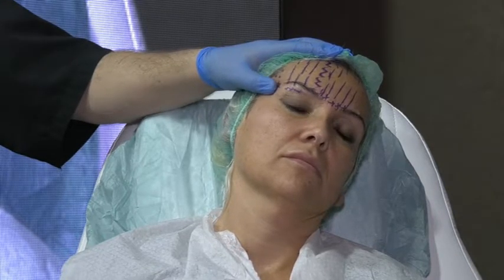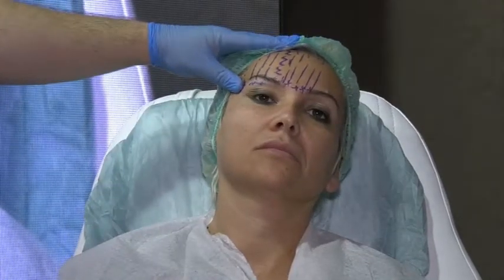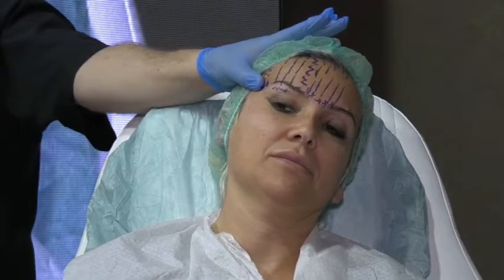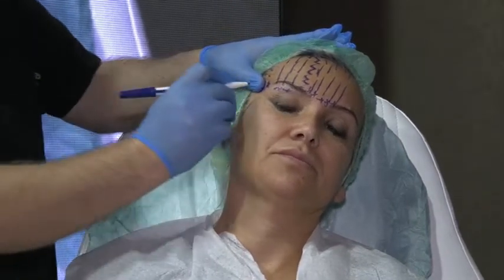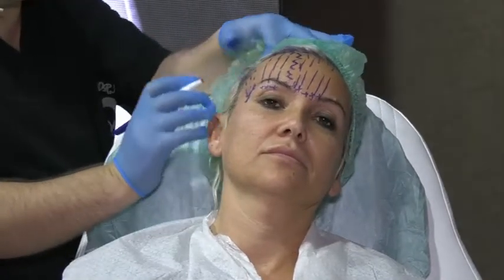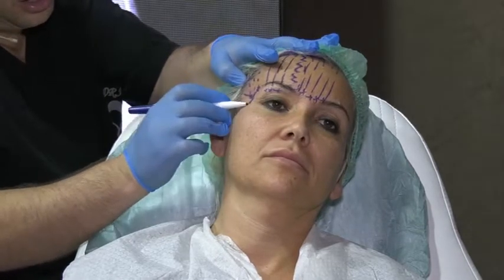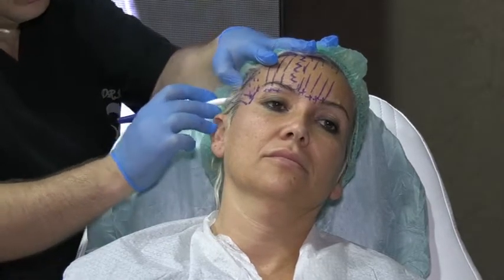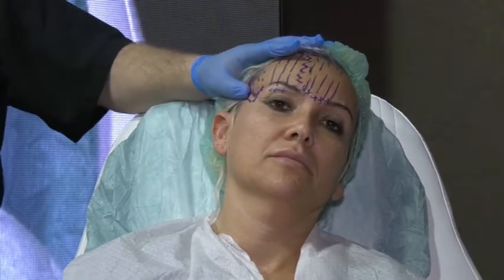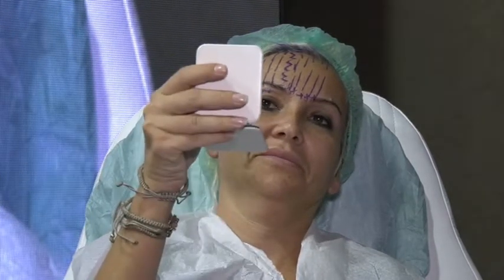This is my hand, right? I put the thread the same as my hand. She wants that? Madam, you like that? Yeah, I love it. Look at the direction of my finger. This is the same direction of the thread. This is number 1. This is number 2. And these threads, we're going to go like that with the same direction. So that's what I will get, because this is what I did. So this is the first way to create what we call a cat eye.